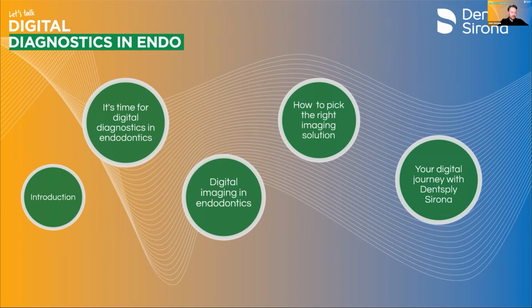Yeah. So low dose imaging is tailored for specific mediums. You wouldn't use low dose on an endodontic case, though as a secondary finding, a low dose could be useful. Generally, low dose will be used for perhaps orthodontics or for implant planning. For implant planning, all you need to see is the height, the depth, the width, perhaps where the ID canal is, so low dose is ideal for that. For endo, like Kreena said, you're looking for as much detail as you can, so high definition is the way to go. And that's what the guidelines say as well, in the studies that I think Shannon Patel did a couple of years back.